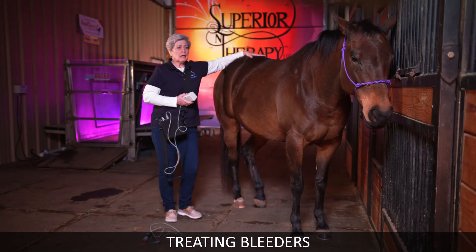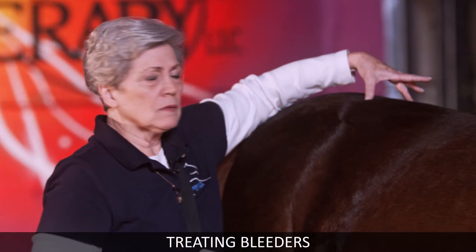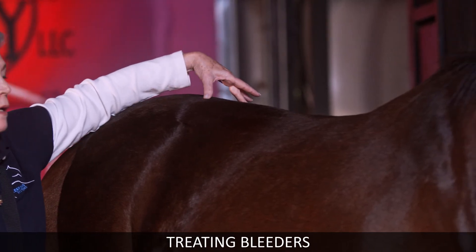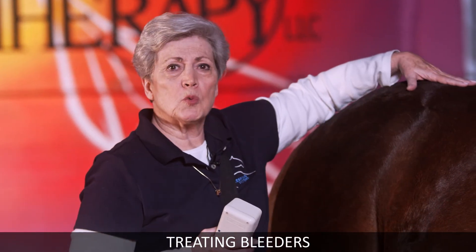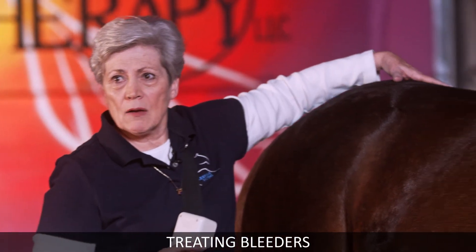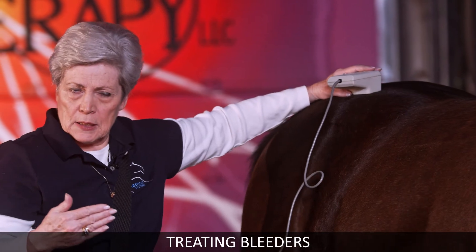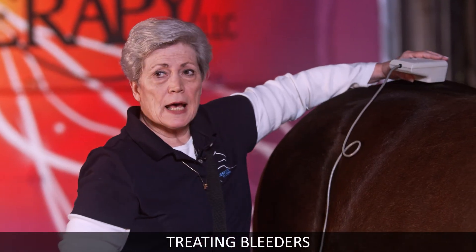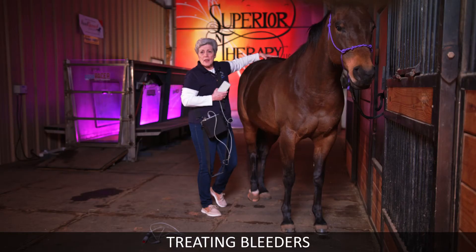I want to talk about bleeders. There are respiratory points you can treat, but one of the main things for bleeders is right here, right behind the saddle — this area can even be swollen when you see it. Press right there and be sure to do both sides, all across. I'm using the wide head because normally it's swollen. Anytime you have swelling, gently open up the capillary system to let the swelling out first. Treat here, here, here, and then the other side in the same places — these are the actual bleeder points.